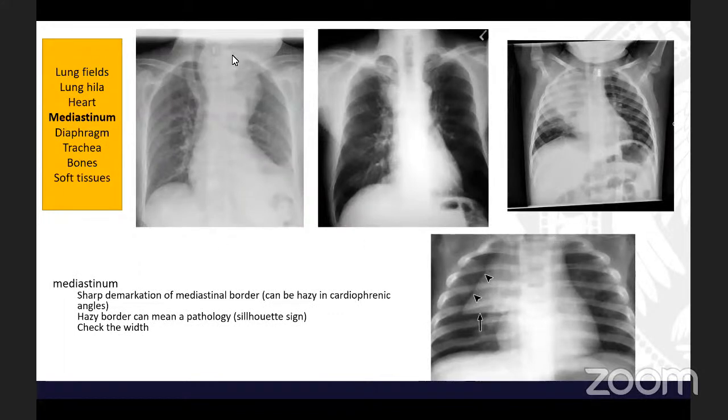The fourth thing is the mediastinum. We will check the upper part of the mediastinum. There are two main things that you should look for, and the first is the size of the mediastinum, so whether it's enlarged or not. It's usually enlarged because of some mass in the mediastinum. Like here, it should not be here. This thing is probably lymph nodes. It can be a lot of things, but there is enlargement of the mediastinum, and there is definitely a large mediastinal mass here.